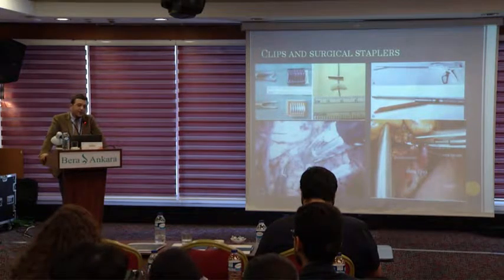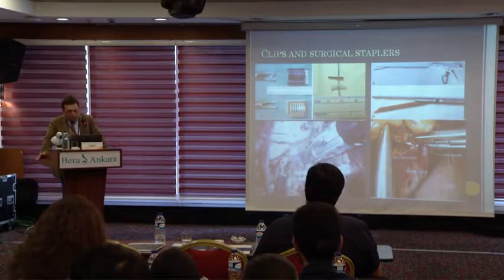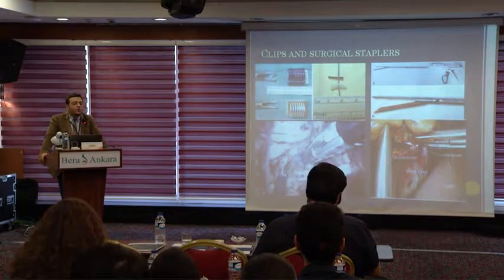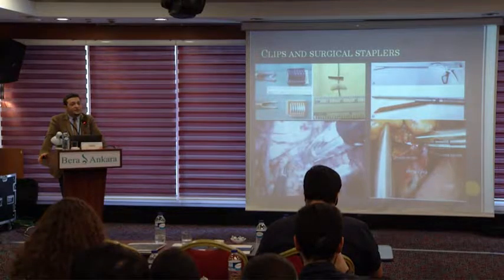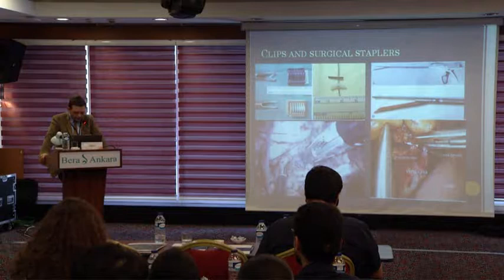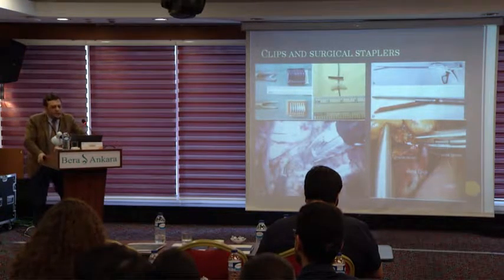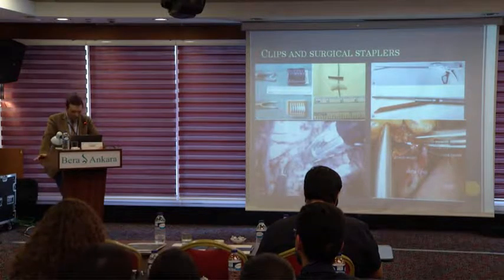Both have advantages and disadvantages, but the Hem-o-lok clips are known as the safest clips. They are in non-absorbable form, or you can use a surgical stapler, Endo GIA. Its working principle is stapling both sides of the tissue and then automatically cutting the middle.